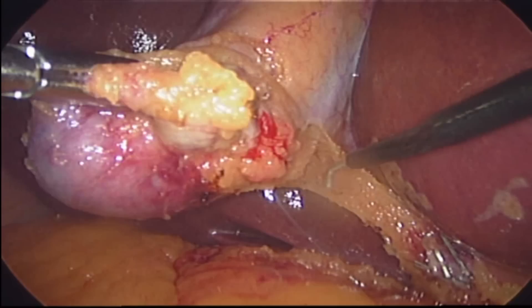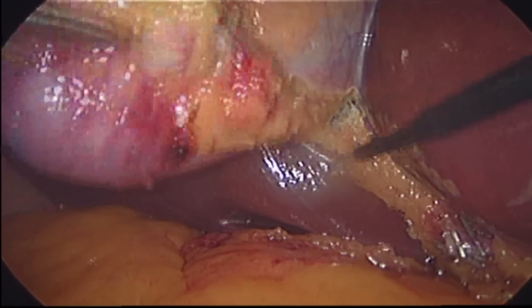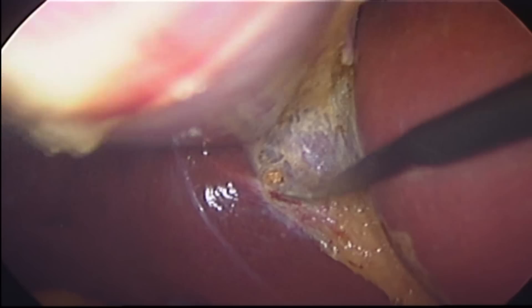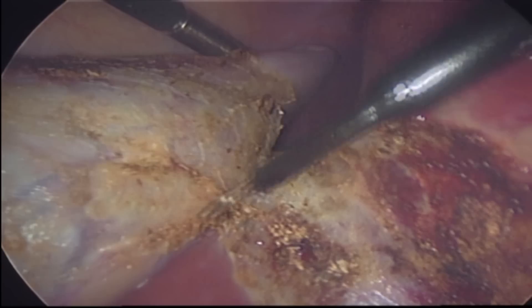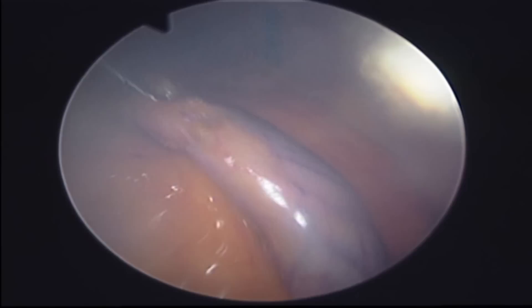The gallbladder is then dissected using diathermy from its attachments to the undersurface of the liver. The gallbladder is then entirely free and is grasped and extracted from the abdominal cavity via the 10 mm port just below the umbilicus.